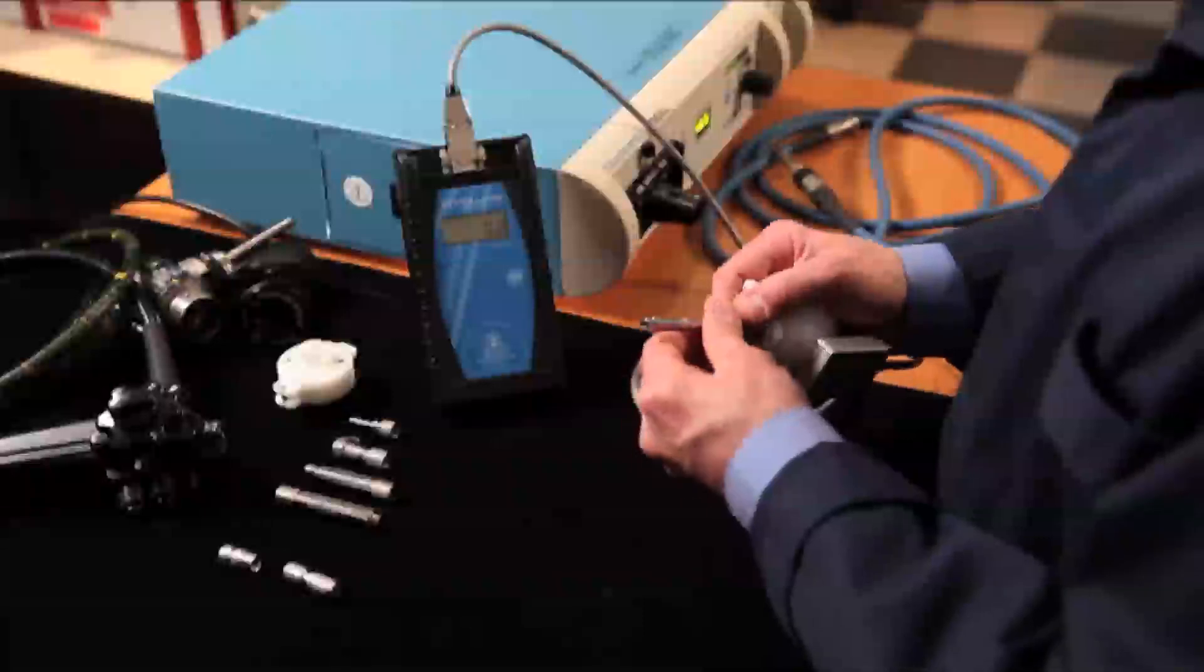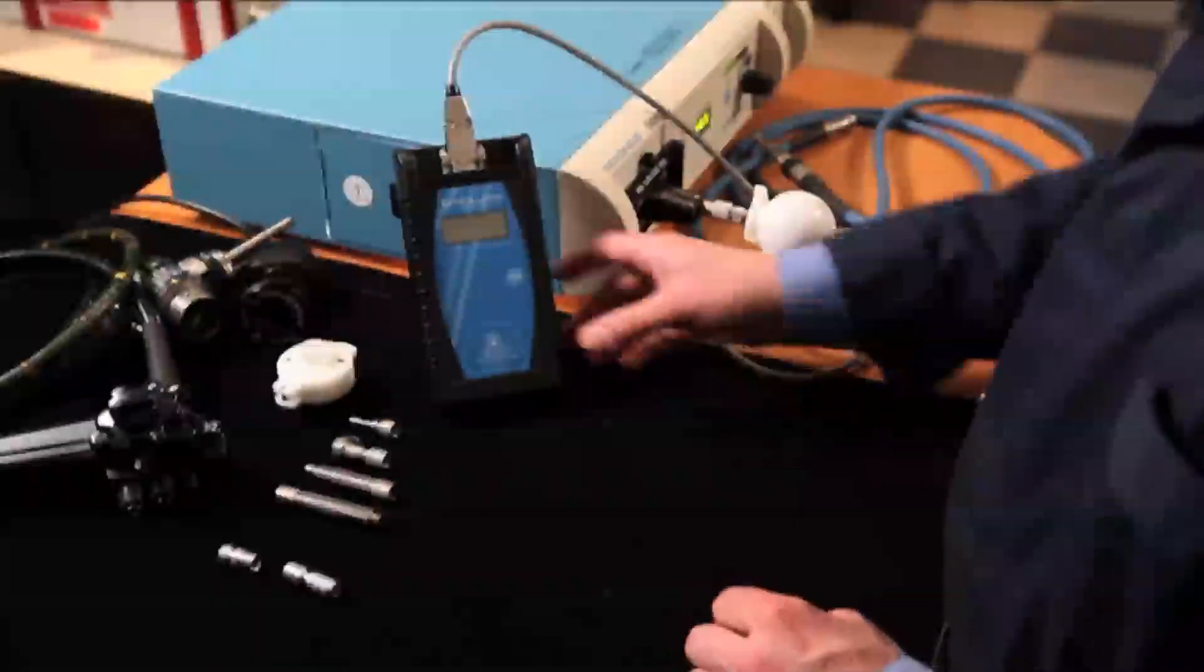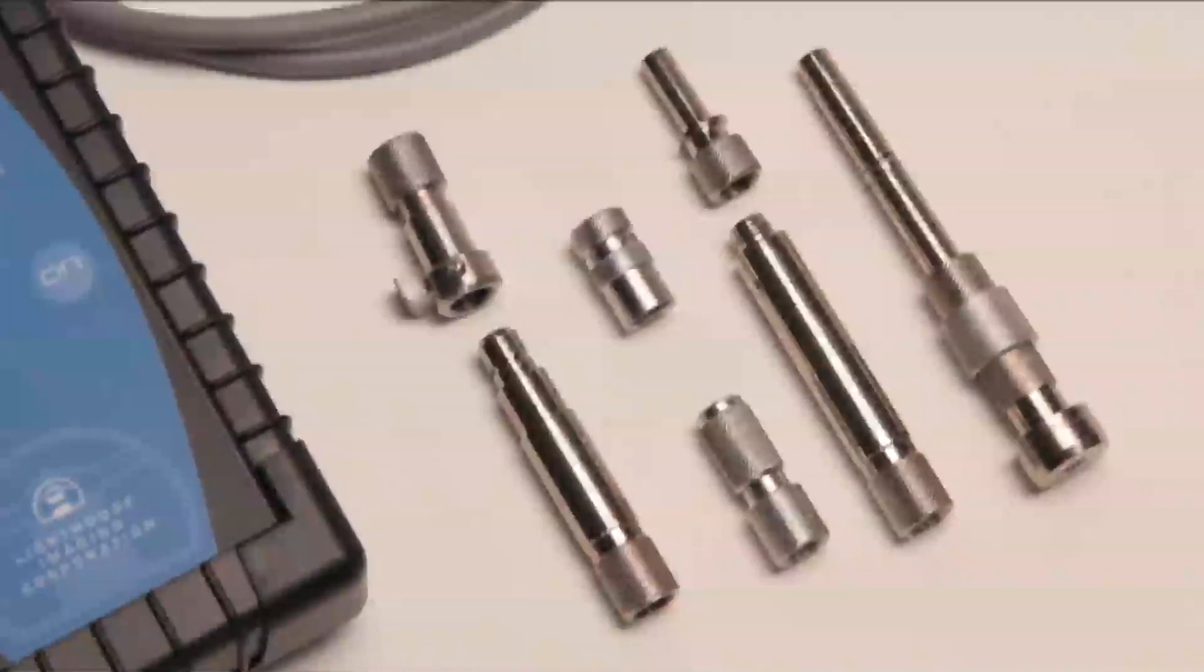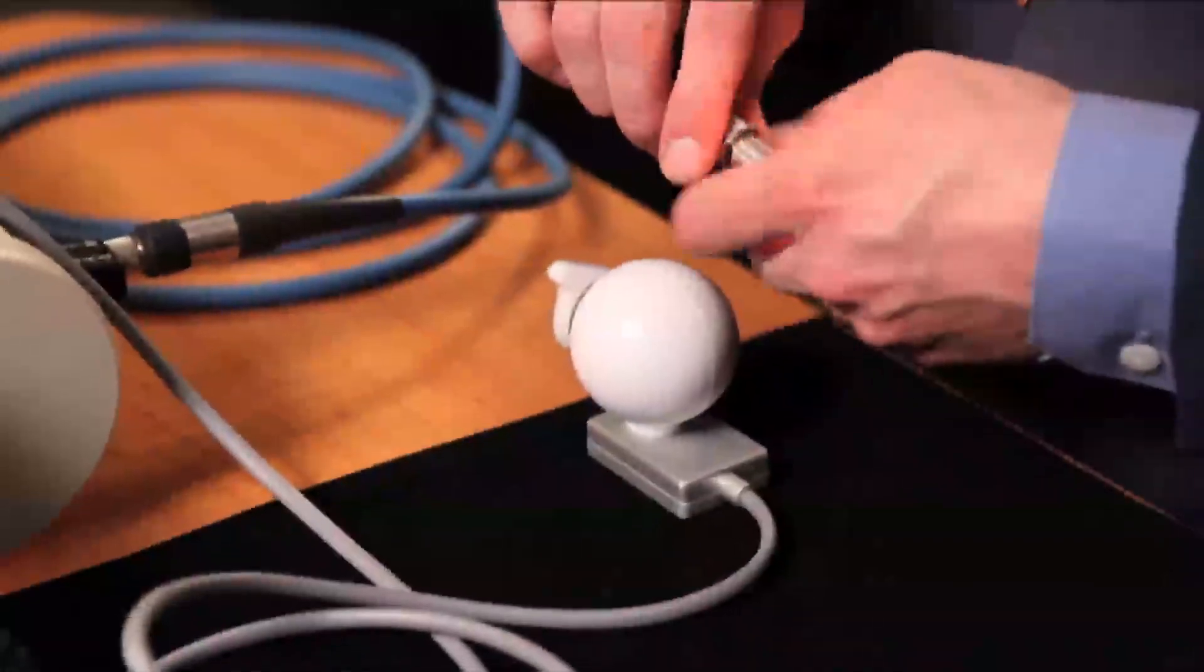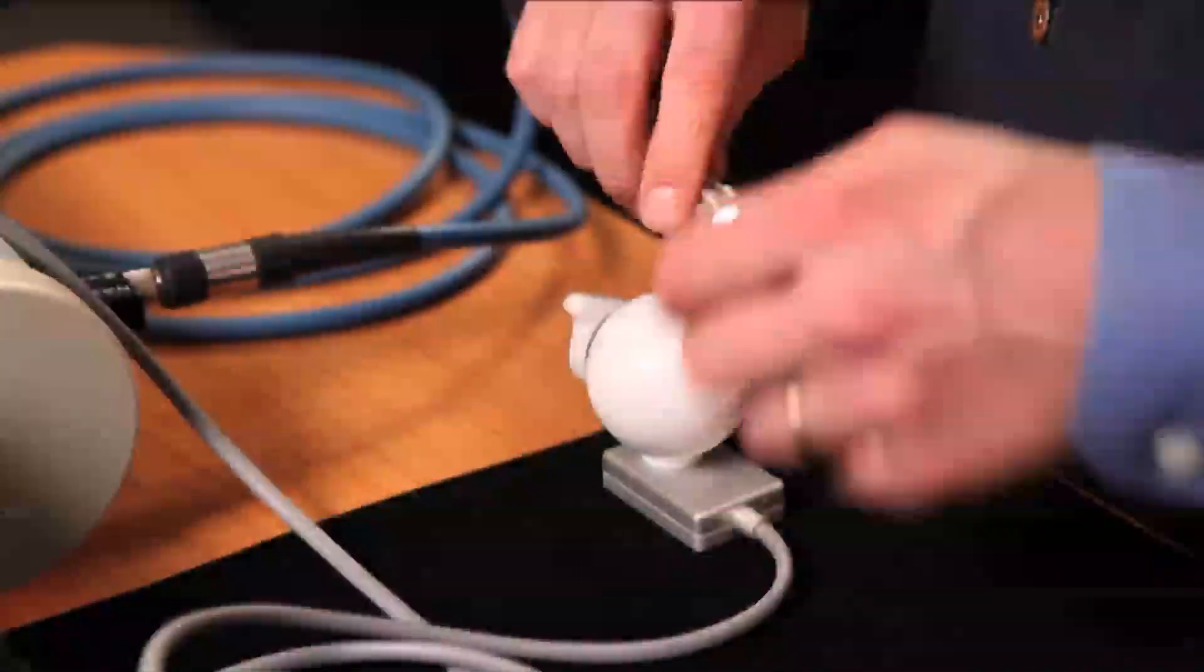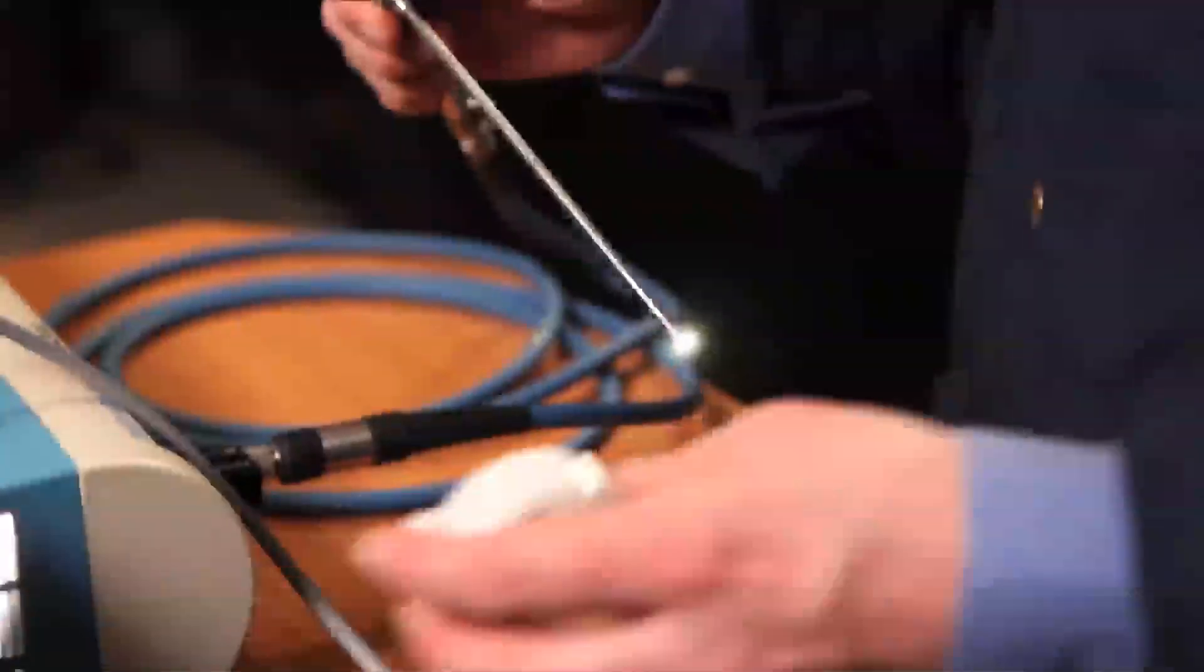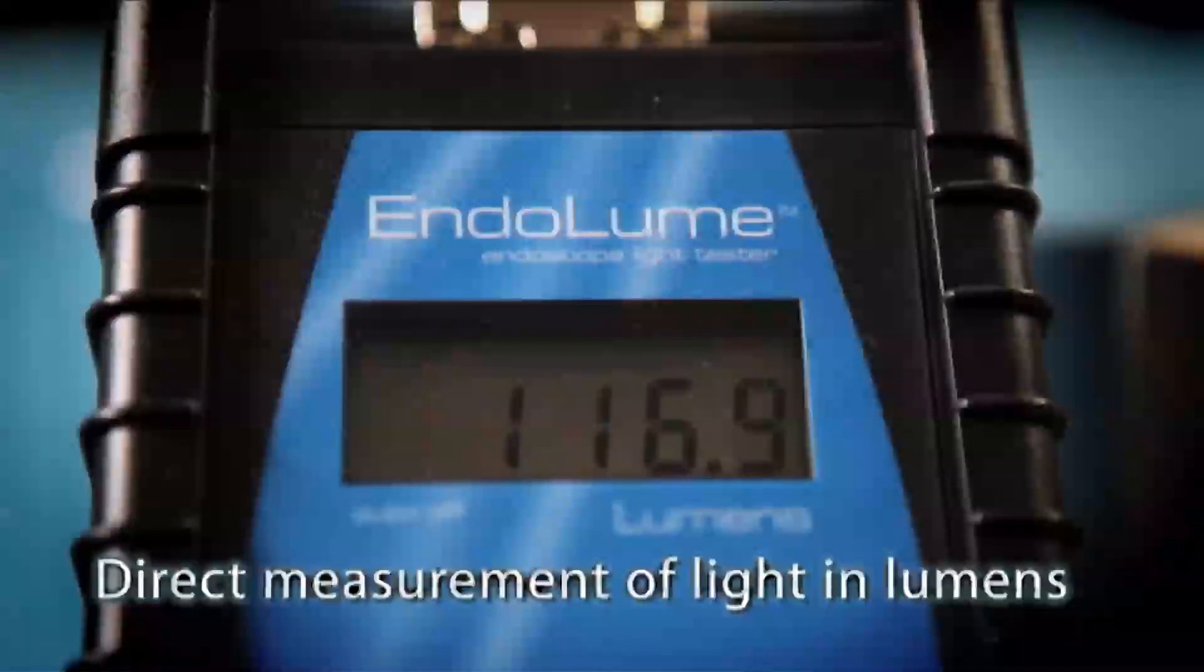All types of endoscopes, both rigid and flexible, can be tested with the Endolume. Included adapters attach to the Endolume and plug into the light source. The Endolume's patent-pending optical bridge uniquely makes accurate measurements inside the light source at the exact position of the light cable tip. The Endolume reads in lumens, a direct measurement of the radiant intensity as perceived by the human eye.